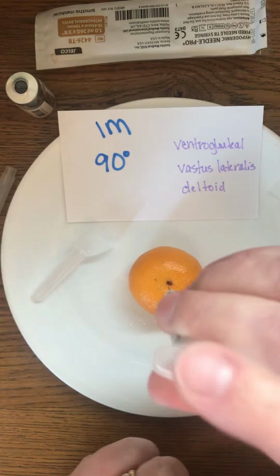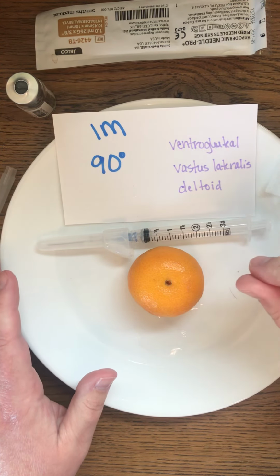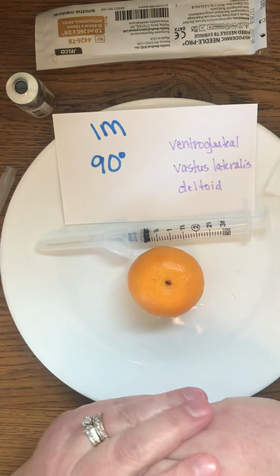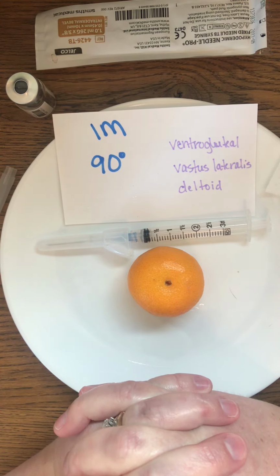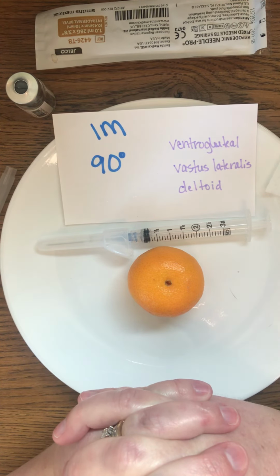Sometimes people's skin is a little bit thicker, and I have actually had the needle go to the skin and bounce off. Of course, you're never going to recap your needle here. You're always going to just activate the safety and get rid of it that way. So quick jab into the skin, go through. There's a good chance at some point in your career you will end up hitting the bone, depending where you give the injection. If you give a deltoid, you may hit the bone, and all you need to do at that point is just back it up a little bit and then go ahead and administer.